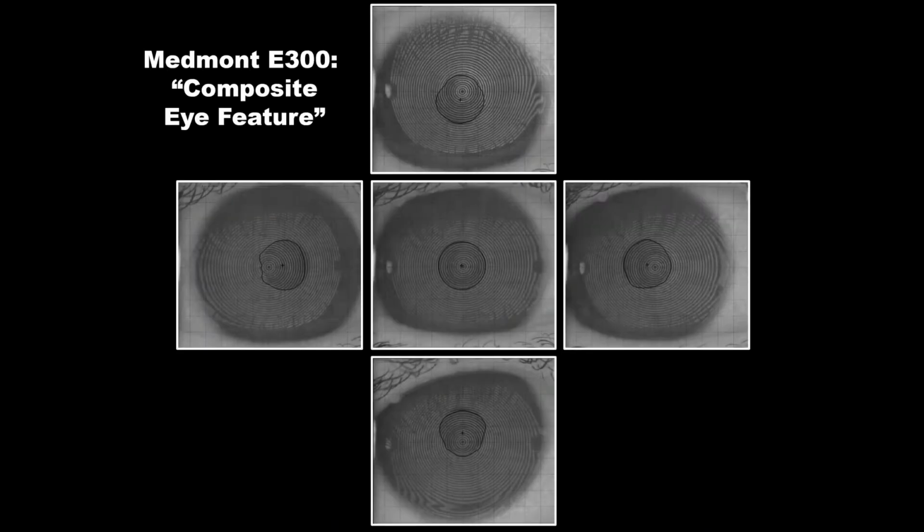So we can use what's called the Composite Eye Feature, and that allows us to take an image on the visual axis down the center of the unit. Then we have the patient looking down. We push the placido to the top. Have the patient look up, pushing the placido reflection to the bottom. Having the patient look temporal, moving the placido to the nasal side. Having the patient look nasal, moving the placido to the temporal side.